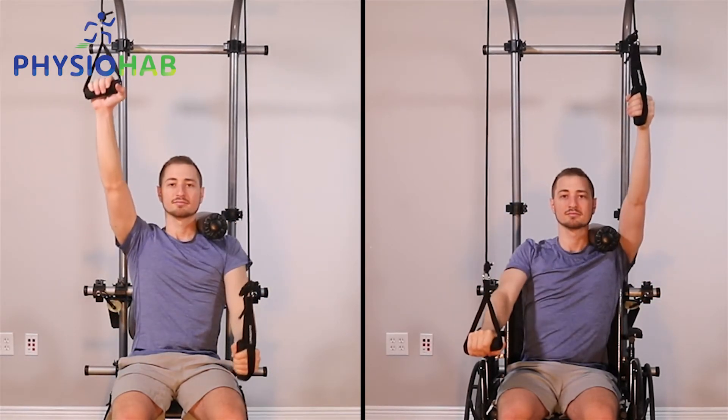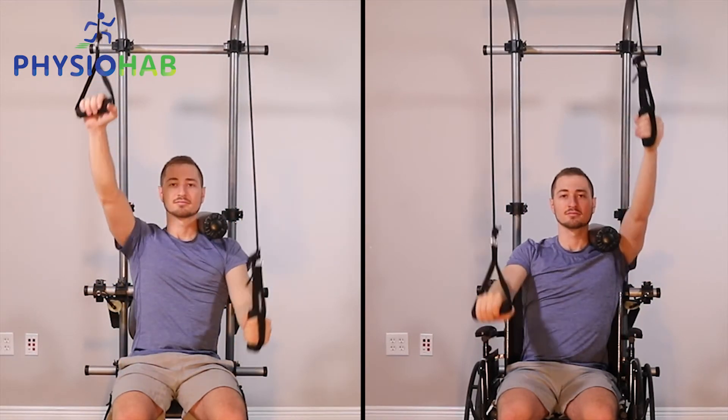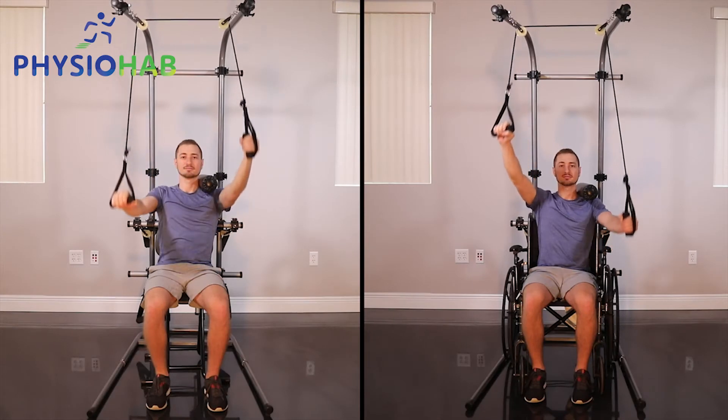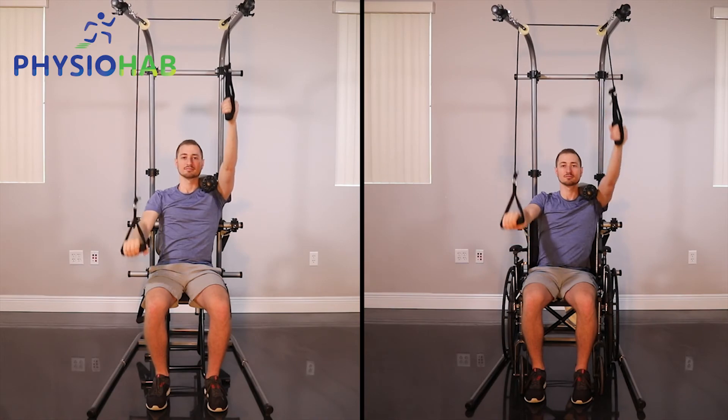You'll notice a stabilization bar over the patient's shoulder, which is intended to prevent excess movement from the scapula and prevent shoulder hiking. This is to ensure that there is solely glenohumeral movement coming at the shoulder joint, to make sure that you're getting a true stretch.